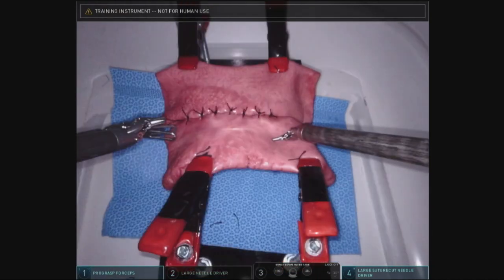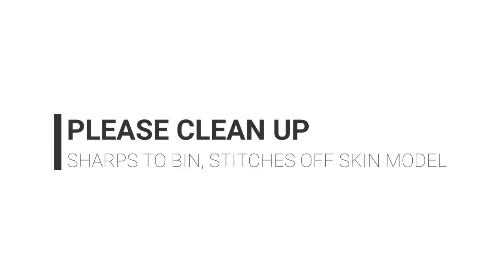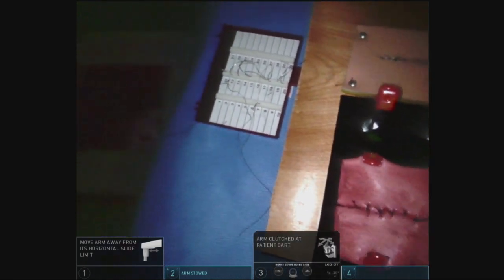If you still have time, you can cut the whole anastomosis out and use the opposite sides of the bowel to practice another anastomosis. Please clean up after yourself, put the sharps in the sharps bin, and take all the stitches out of the skin model.